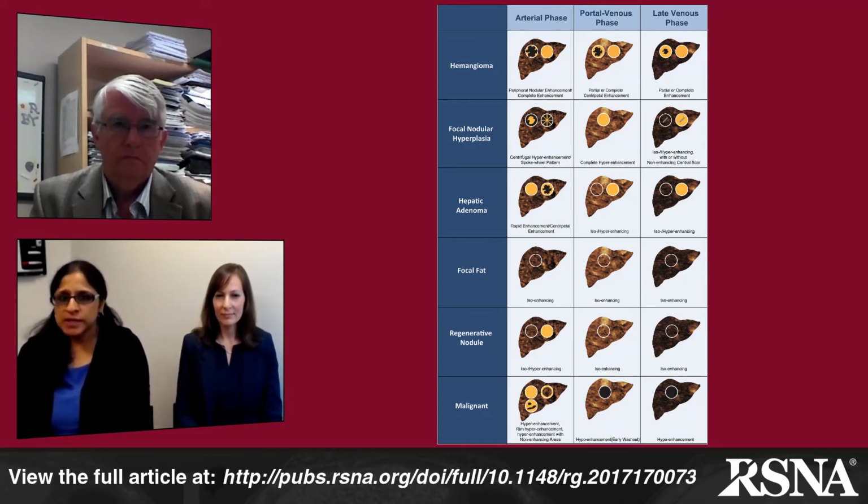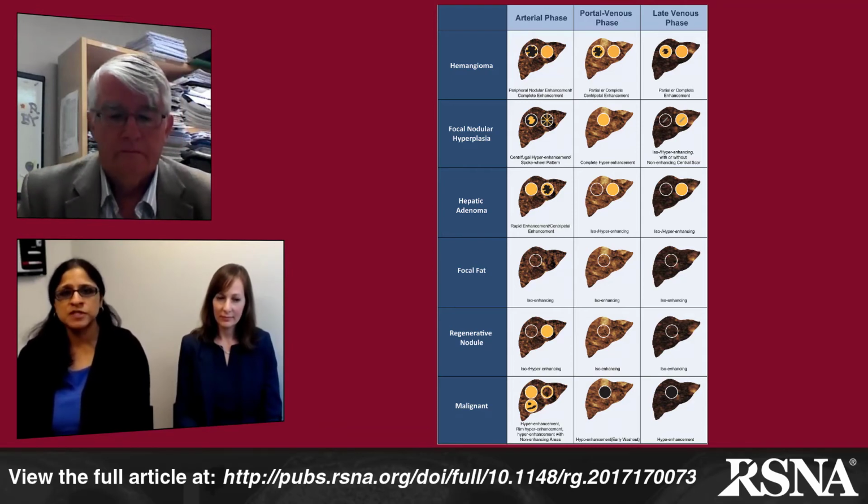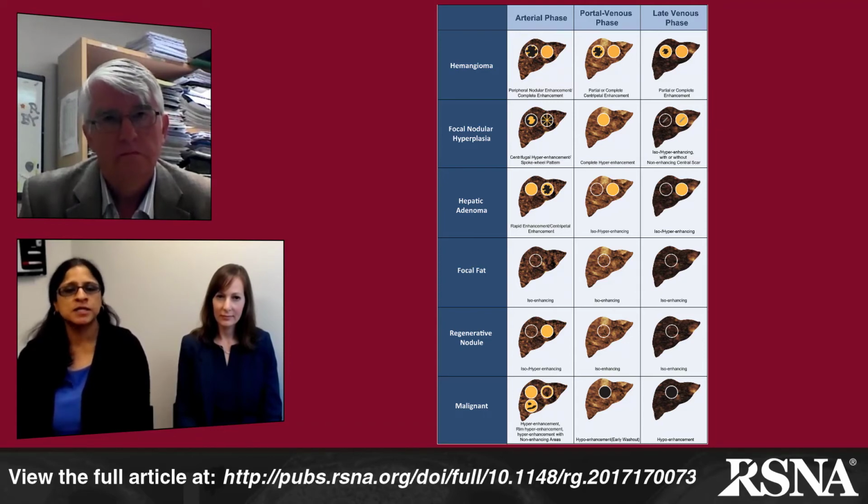We felt that doing the diagram in this way would really help serve as a great guide for those who are trying to interpret these studies. And one of the things we found in our practice was once we had the procedure down, and that seemed to flow very nicely and was well organized, and our technologists and our physicians and nursing staff all knew what to do, the next step was, now how do we interpret these studies? So that was really our goal in putting together this particular figure with each phase of the enhancement patterns.